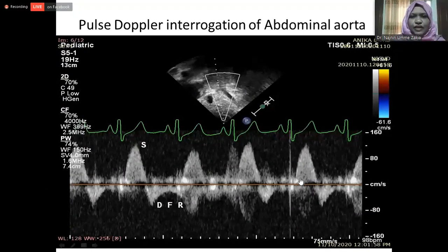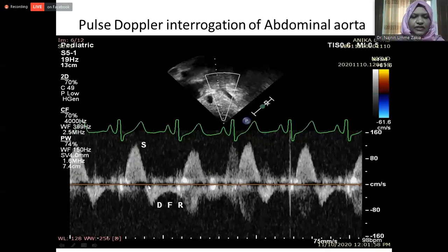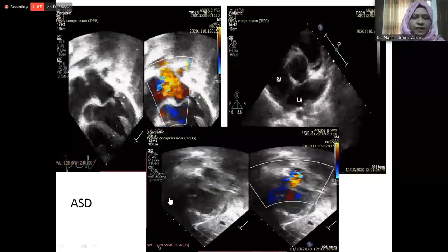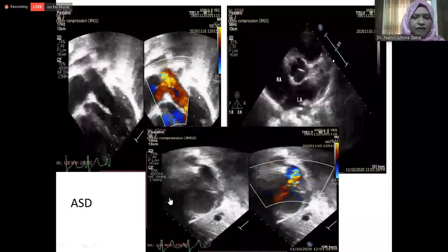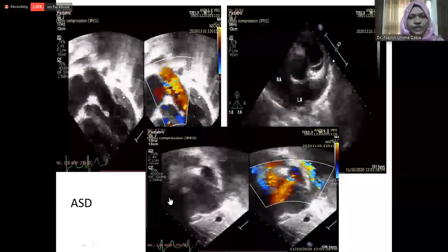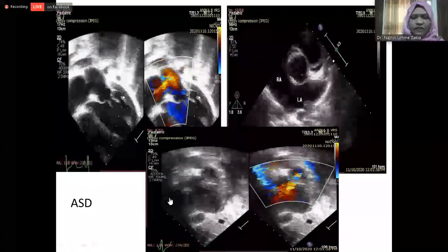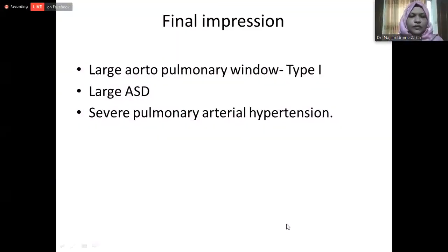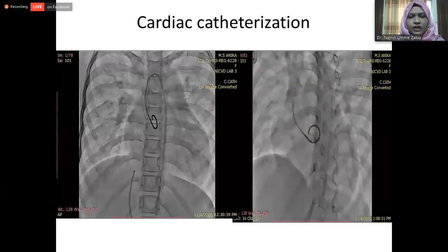This is the subcostal short axis view showing color flow interrogation in the abdominal aorta, demonstrating blue flow — this is diastolic reversal. Pulsed Doppler interrogation of the abdominal aorta shows pulsatile systolic antegrade flow and low-velocity holodiastolic flow reversal, which is important for diagnosing aortopulmonary window. Associated lesions were found: an atrial septal defect was identified and demonstrated in different views. My impression is large aortopulmonary window type 1, large ASD secundum, and severe pulmonary arterial hypertension.